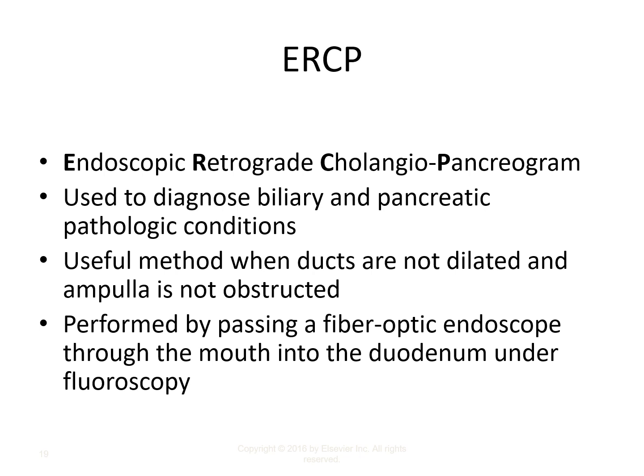Okay, you are there to take an occasional fluoroscopic spot image to assist them with cannulation of the hepatic duct, or I'm sorry, the common bile duct, and then once they have cannulation, to record the retrograde injection.